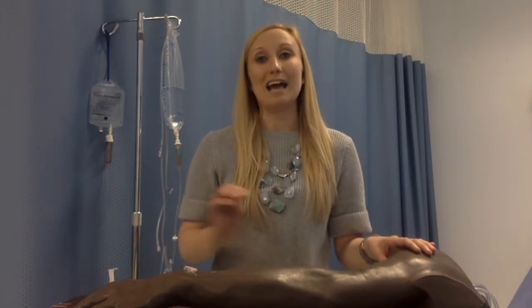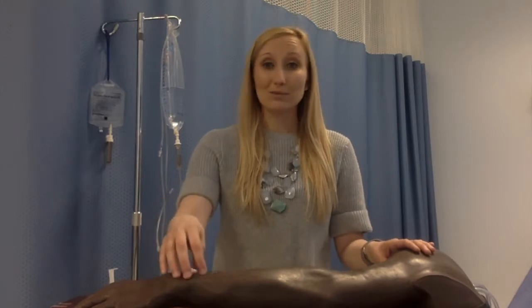So, let's get started. One of the purposes behind IV medication administration is if you have a medication that you have to give 5 or 6 times a day, and it can either be given through IM or IV route, you and your patient are going to choose the IV route every time. A patient would rather be stuck once with an IV and the medication be given through the IV versus having to be stuck 5 or 6 times and the medication be given IM. So that's just one reason.